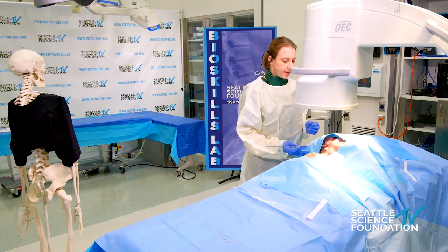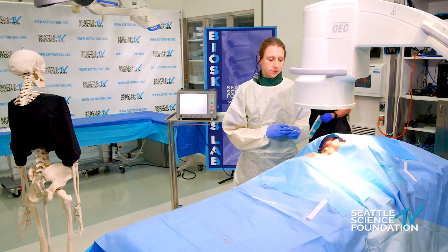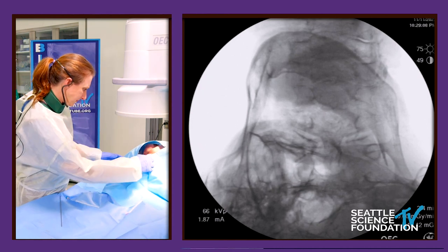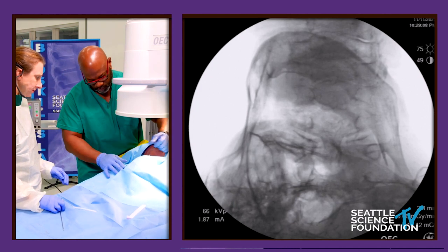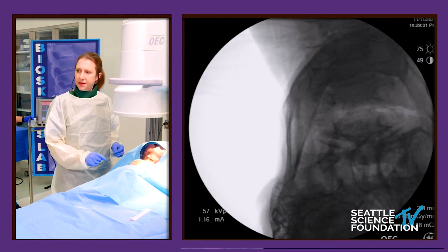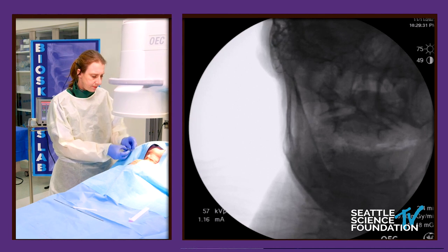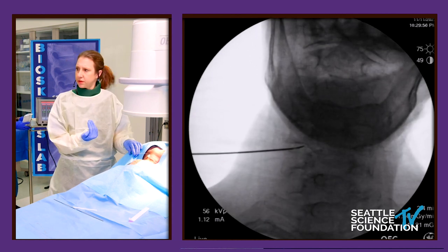John, what I'd like you to do is get an AP view of the cervical spine. Okay, so definitely this is pretty rotated. Okay, let's try that again and see what we've got. Could you go a little higher? Actually, the image is upside down. That's one of the things that's throwing me off. And then lower it is, not higher, this direction. Oh, sorry. No problem. Okay, picture. Okay, so could we center that, meaning moved, I think it's moving toward, yeah, thank you very much.